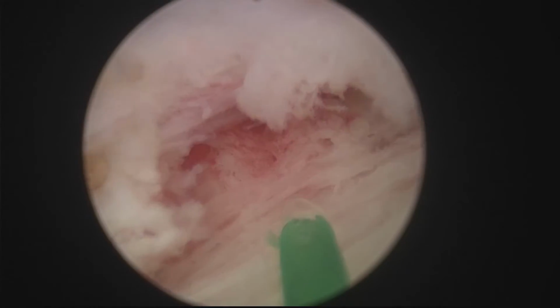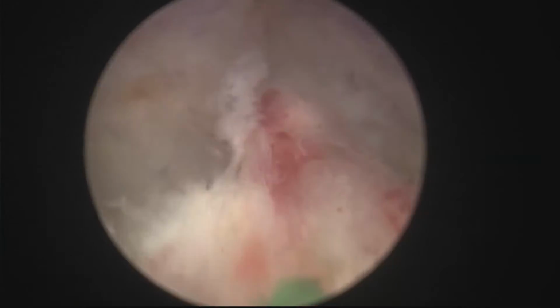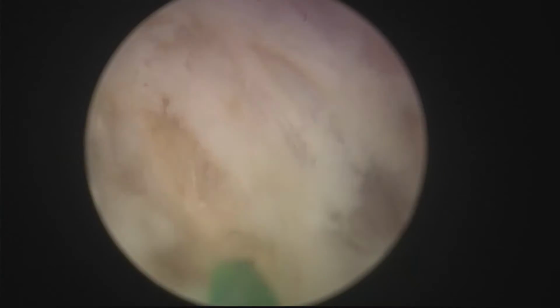You see, usually when you push in that region, the plane opens for you, but we mustn't forget that this man is a reoperated man. Most likely after TURP, the remaining prostate and the remaining adenoma probably undergo fibrosis and inflammation, and it is not unusual to find that these redo cases are a little bit difficult because of that.